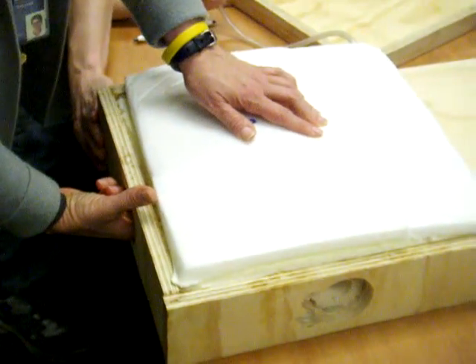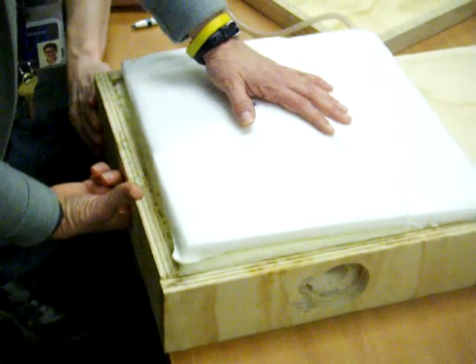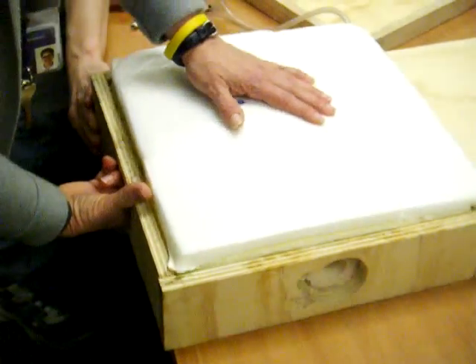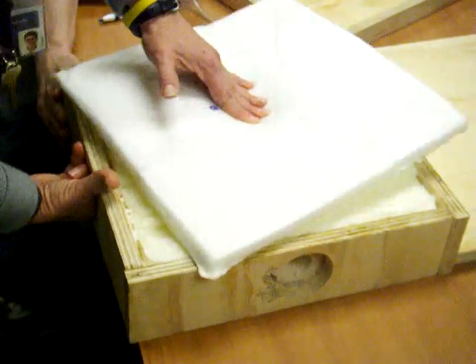I'm going to insert a vaginal hand so that I can ideally apply pressure and have the uterus between my abdominal hand and my vaginal hand. That's what would be much, much more helpful. And now I'm going to massage the uterus.